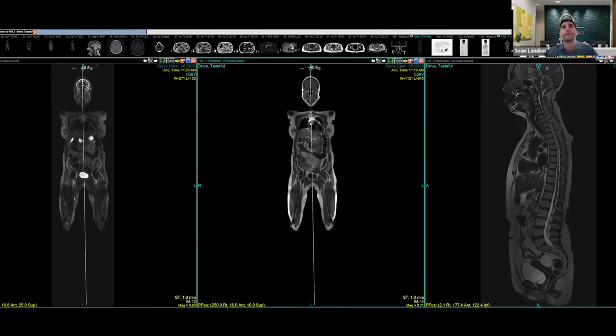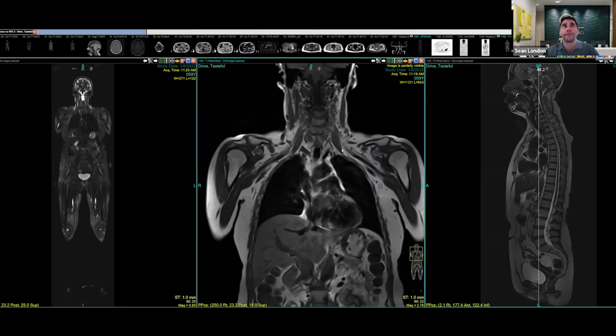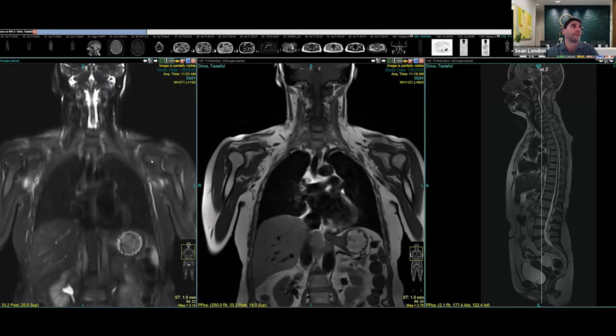The way that we can do this is I can zoom in a bit to get a better visualization. So this is the right shoulder, this is the left shoulder, and what I'm looking for on this set of images is any signs of arthritis, and what I would be looking for are bony spurs coming off these joints. I don't see that here. And then on this set of images, this is looking at fluid and swelling, and if there is any abnormal fluid surrounding the joint, it would show up as bright white. This is all physiologic. Any bone marrow edema, which is swelling, would also show up as bright white. And I don't see anything concerning there.